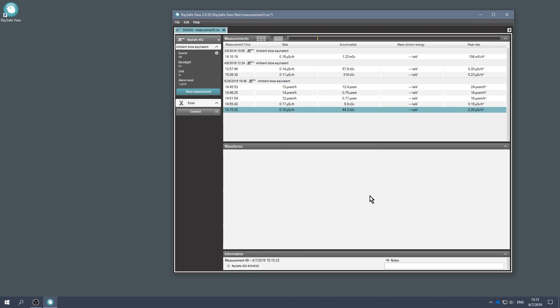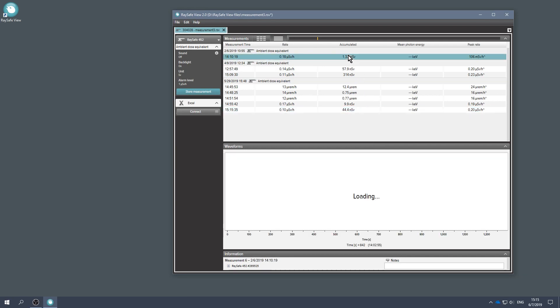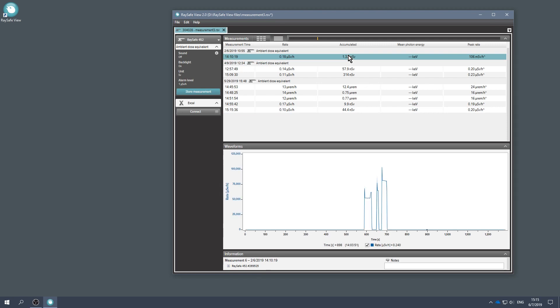Each measurement has a row in the list. Click on a measurement to see the waveform.